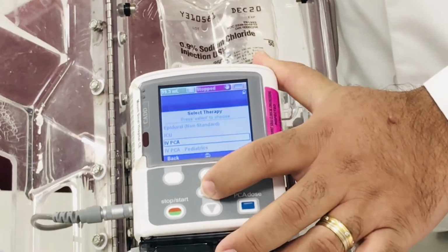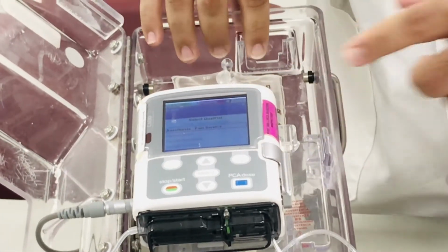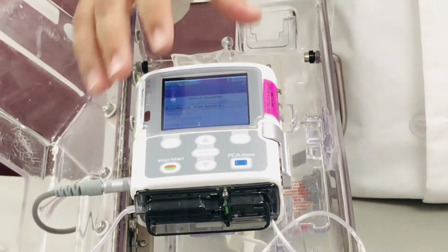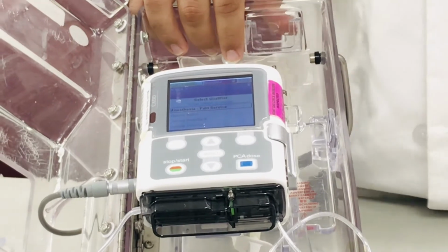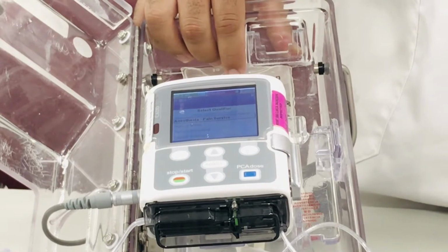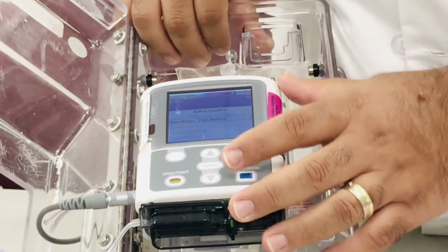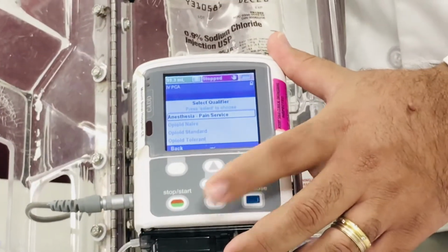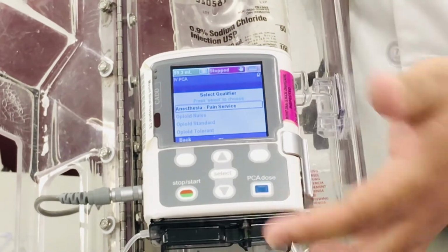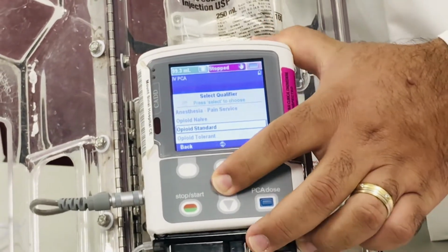So we're going to select IV-PCA, and then is it an opioid naive patient, an opioid standard patient, or an opioid tolerant patient? And that's where it's important to know the substance abuse history of your patient, or how much they were medicating themselves before they came to the hospital, especially for patients with chronic pain. So we are going to select someone that's opioid standard, someone that has a condition where they've taken opioids and now they're getting surgery, let's say, and they need a PCA. So you're going to select opioid standard and click select.